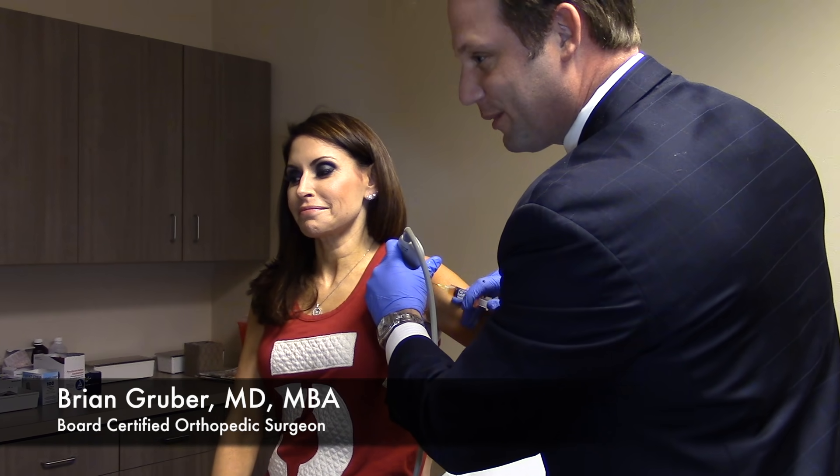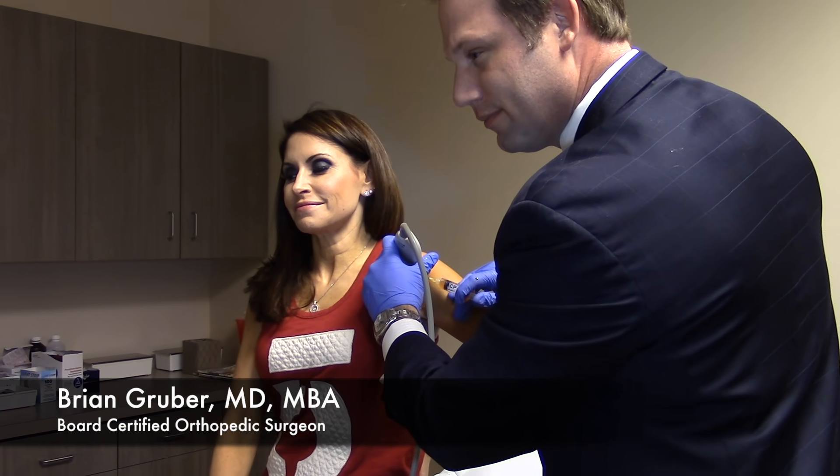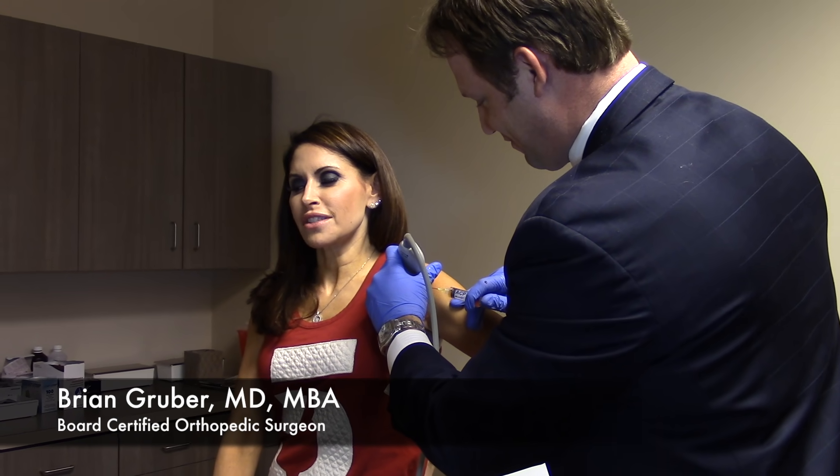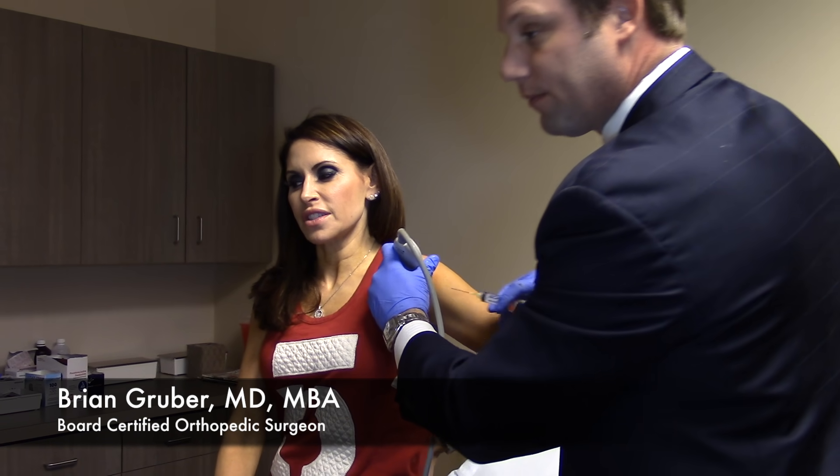Are you doing okay, Julie? Yeah. Are we getting close? We're very close. It's not painless but I'm not crying — just a little uncomfortable. All right, and now we're done.